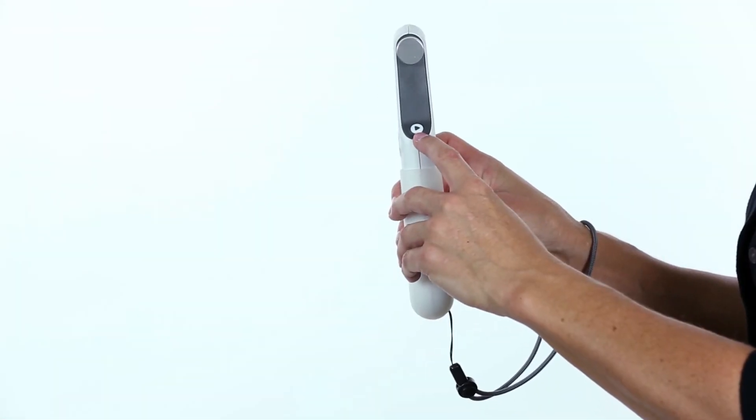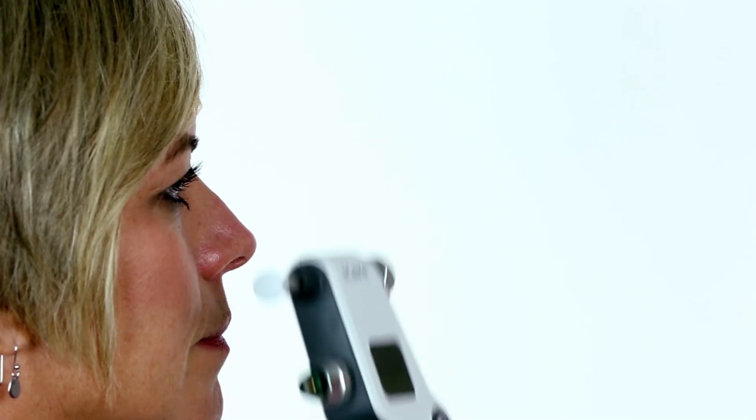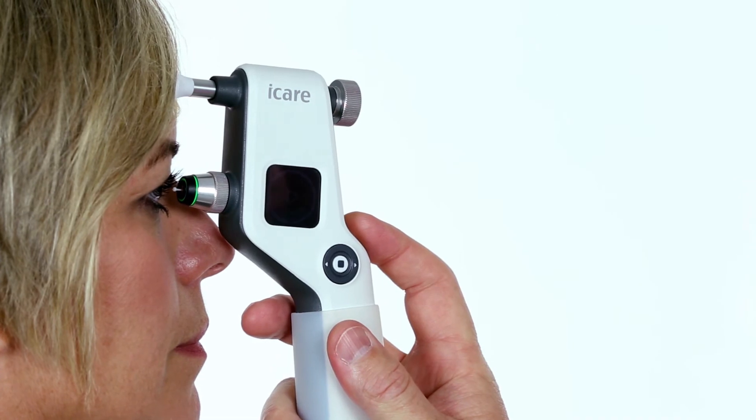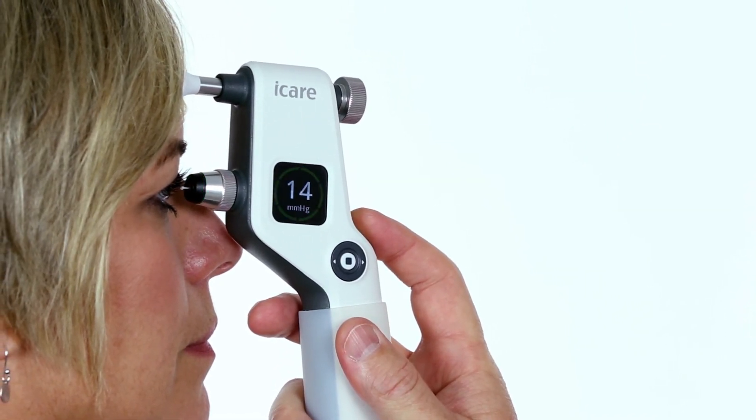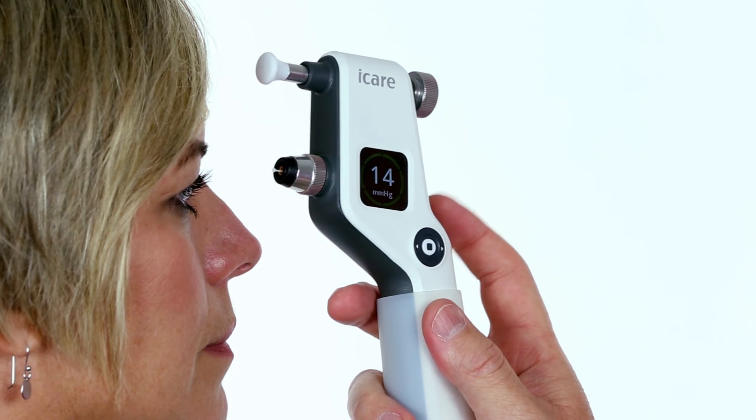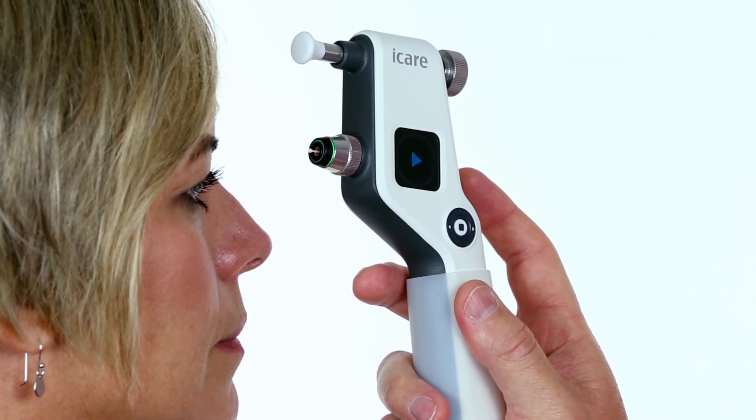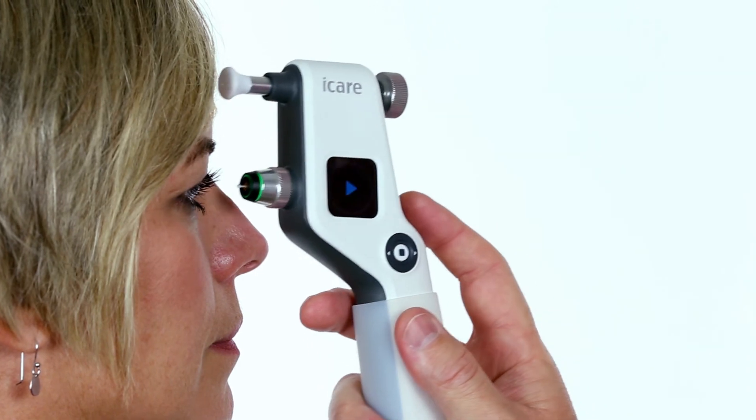Press and hold the measure button to perform the automatic measurement series. Six measurements are taken consecutively. Once the measurement is complete, you will hear a long beep and the final pressure will show on the display. Press the measure button once to clear the reading and repeat the same steps for the fellow eye.